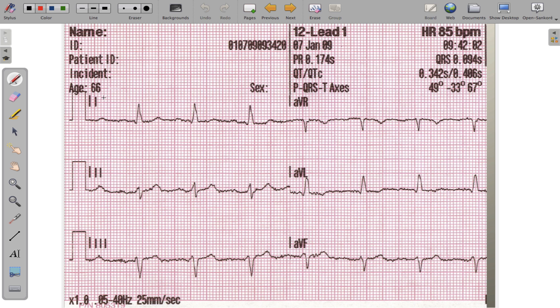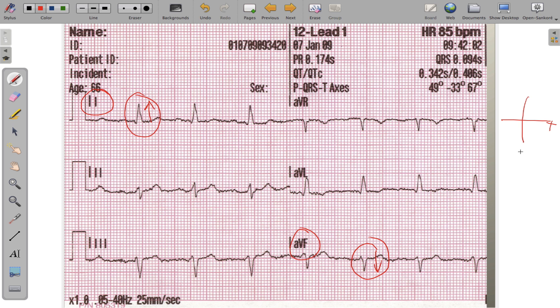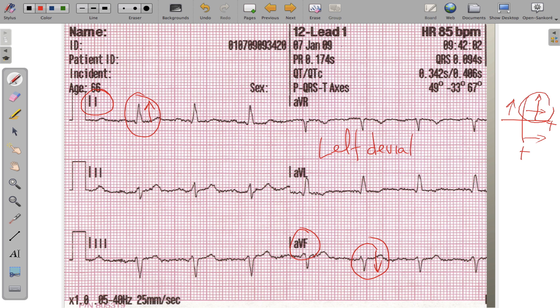In the second example, lead 1 is predominantly upright and lead AVF is inverted. Using the quadrant grid: an upright lead 1 means traveling toward the left arm; a negative AVF means traveling upward. Their overlap falls in the left-axis deviation quadrant. The EKG machine confirms this with a calculated axis of negative 33°, consistent with left-axis deviation.